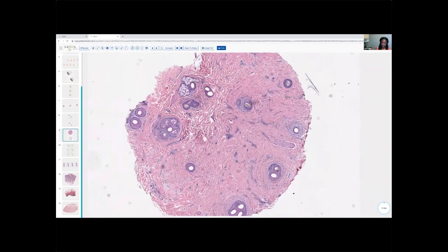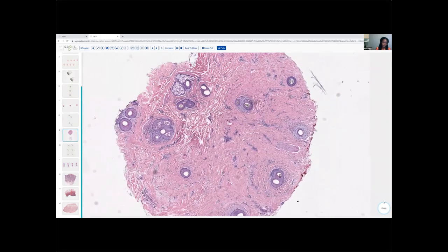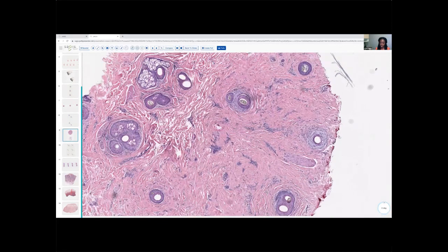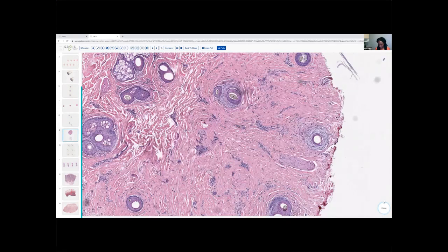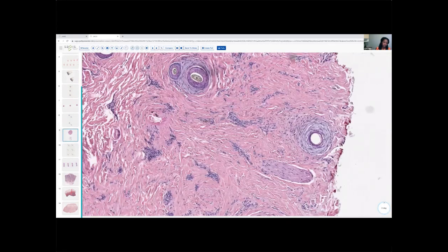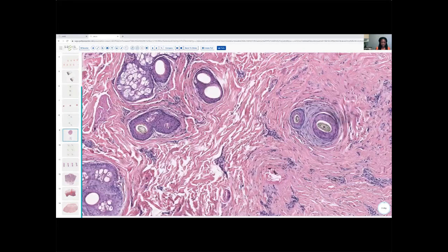And so let's look at the actual follicles, what's going on there. And that's a nice open follicle with a normal structure. We see that inner root sheath that is as it should be, intact. While compared to this, for example, we have that inner root sheath and it's kind of fibrillar. It's breaking down essentially.